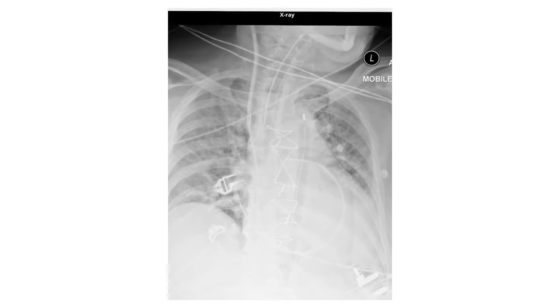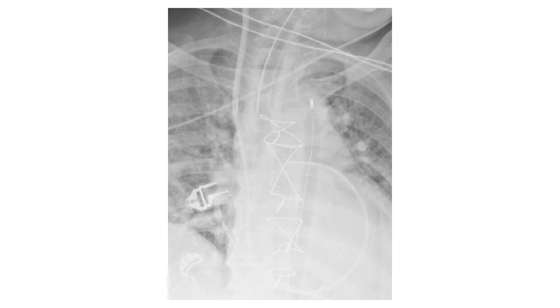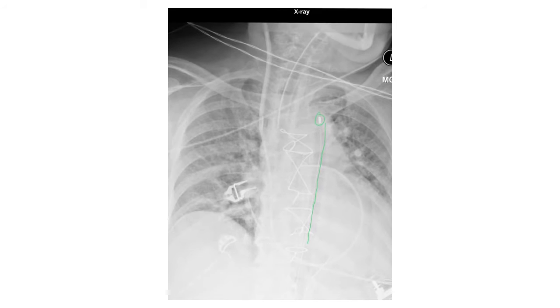When there is a balloon pump you need to identify the chest x-ray and look at the position every day in case the cardiologist forgot. If there is a malposition of the balloon pump, as you see here we have a catheter coming from all the way down from the femoral artery. See just follow this green line and here you see the tip here, this is the balloon, this is an intra-aortic balloon in good position. So you need to every day look at the chest x-ray, make sure it's still in good position. This seems a guy who just had CABG because you see the sternotomy wires here, you see Swan-Ganz catheter here, and you see an ET tube here, vascular congestion, hypoventilation, typical ICU x-ray.